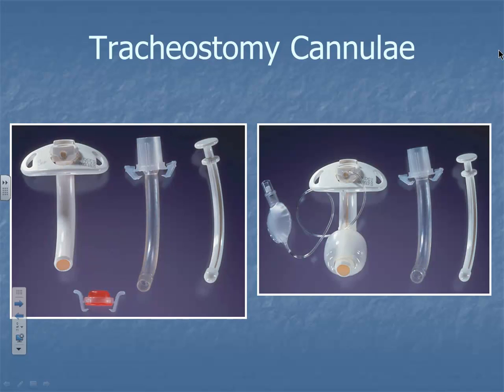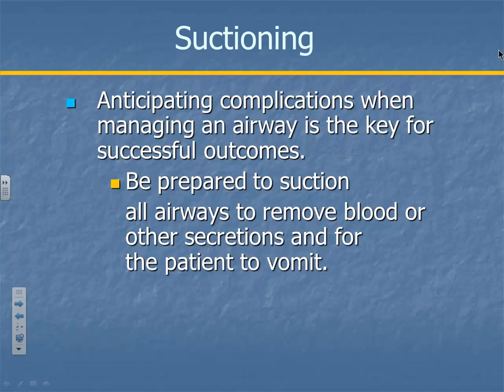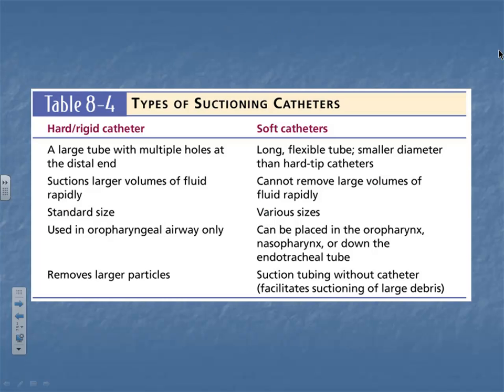So when you do your respiratory rotations, have y'all done those yet? Okay. Make sure you ask a lot of questions and get them to show you anything that you may see in the field, because you don't want to come across something and go, what in the heck is that? So get them to show you everything. Be curious. And when you're suctioning, be prepared to suction all airways. Y'all know that, don't you? You know the different types of suction catheters, right? You know how to use them.